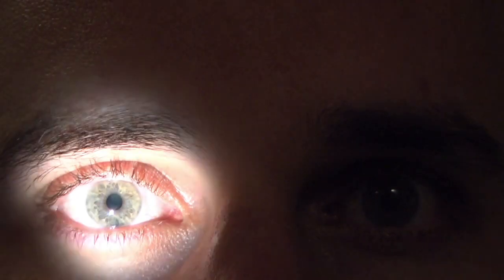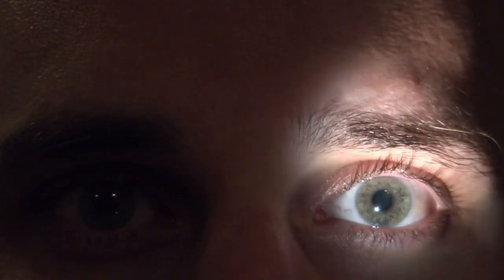In dim clinic light, with the patient fixating at distance, shine the light into the right eye, observing the amplitude of the contraction phase. After 1 to 2 seconds, the pupils will start to give way and dilate. This cues you to quickly swing the light over the bridge of the nose to the left eye. The normal response of the left eye is to constrict. An RAPD would be less contraction compared to the other eye, or with a large amount of damage, relative dilation.